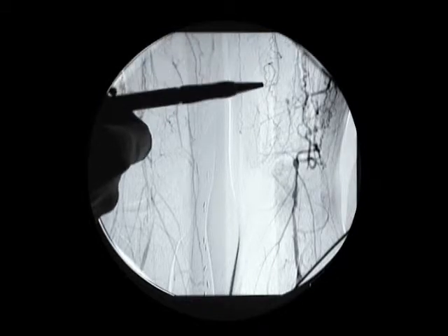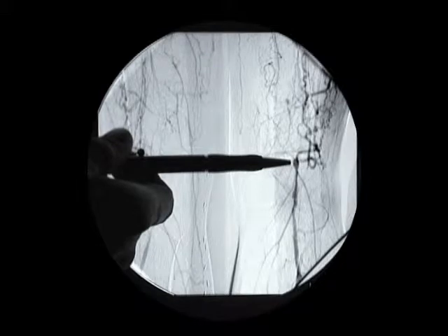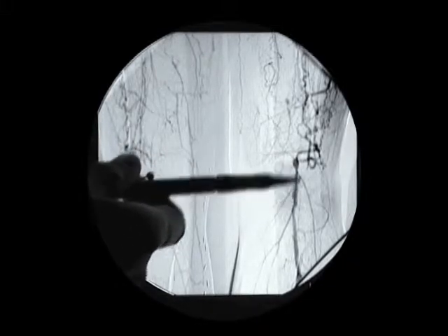This contrast angio runoff demonstrates a very different appearance in the right and the left legs. On the left, the superficial femoral artery is clearly occluded with reconstitution of the popliteal artery behind the knee. There is diffuse disease behind the knee, though there are geniculates which can be seen, and the below knee popliteal is seen to be quite a good quality vessel.